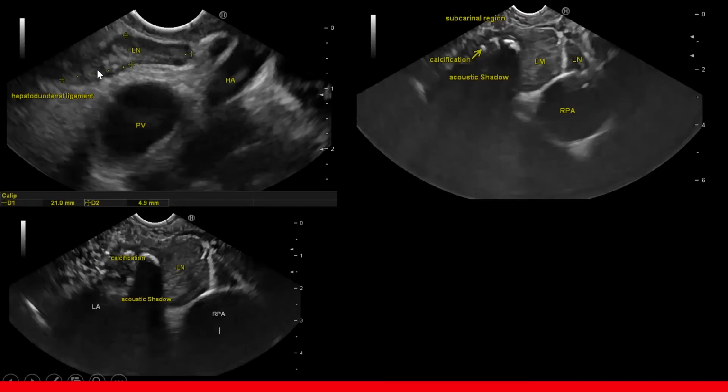Now when we see a lymph node like this on EUS, as we can see, this lymph node is not round, it's not oval, it is elongated. The long axis to short axis ratio is more than 1.5. There is a central hyperechoic hilar structure. It's not well defined, which basically indicates that this lymph node in the liver hilum is non-pathological.